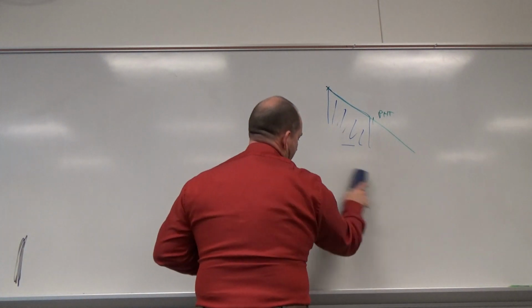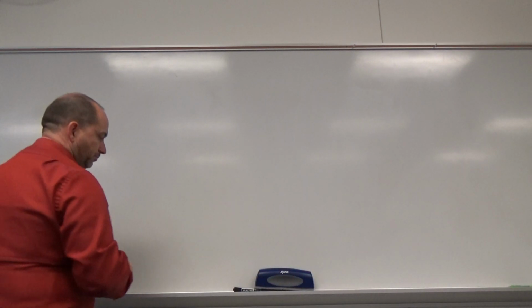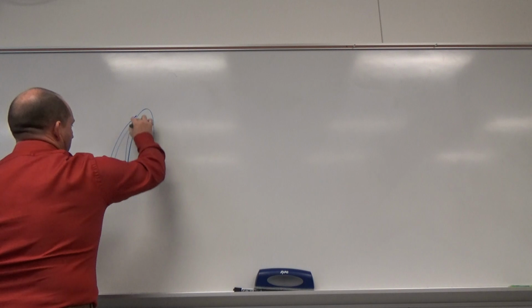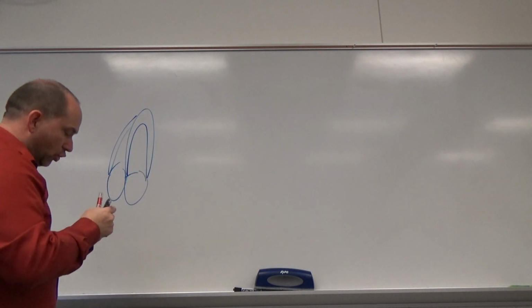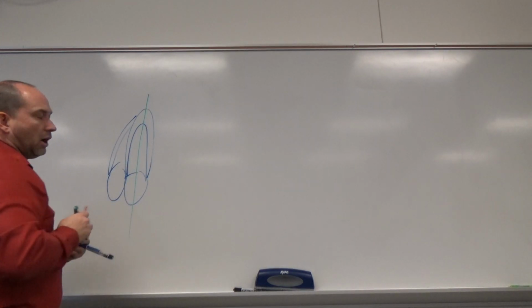Okay, 4-chamber, 5-chamber is done. Let's now go to the 2-chamber. So I'm going to redraw the 4-chamber because I want to emphasize this point. If I want a good 2-chamber view, I'm going to go exactly down the middle of that chamber.